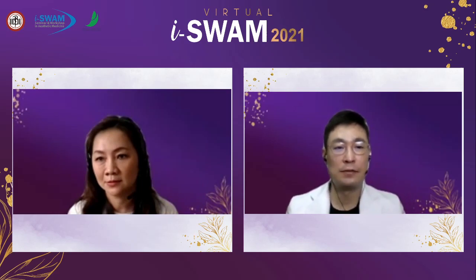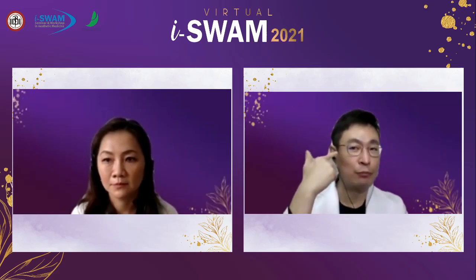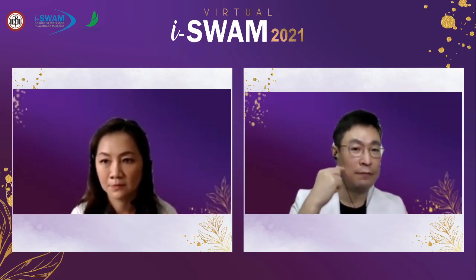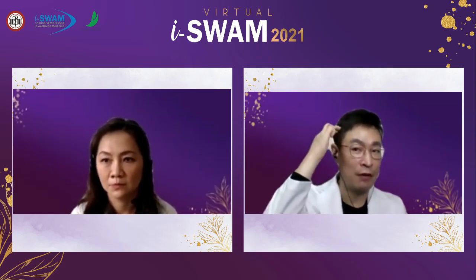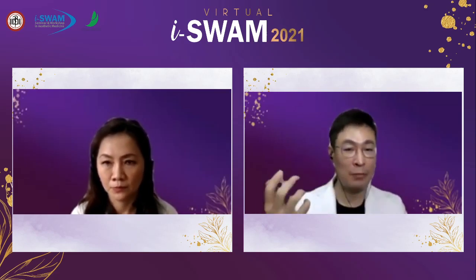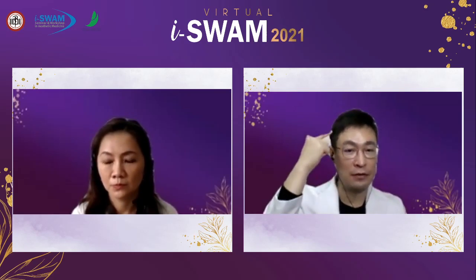Of course, it's better to combine them, because when we put the thread from here to there, the surface covering is quite small. But if you put a few more threads in this direction up to there, then the treatment result will be much better because you are using a larger surface of the face.